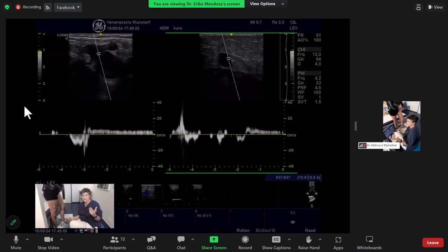Normally you make Tessari, which is 1 to 4. If you use 1 to 7, the foam is very viscous, and you can control the extension better. But nevertheless, if you want to preserve the saphenous vein, and this is what we try to do in CHIVA, you shouldn't handle foam next to the saphenous vein.